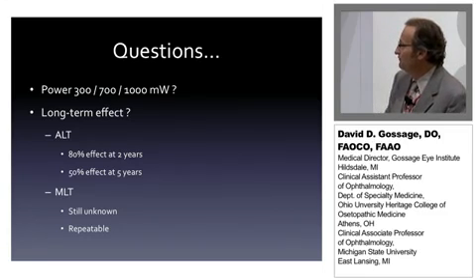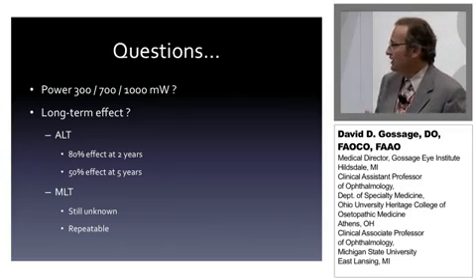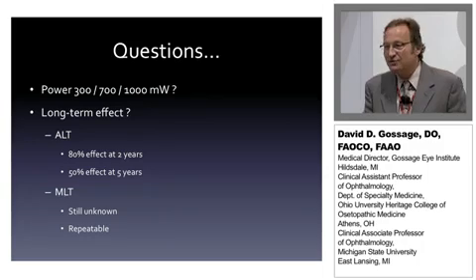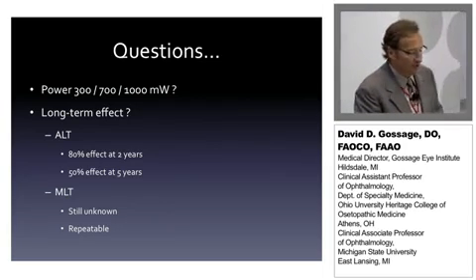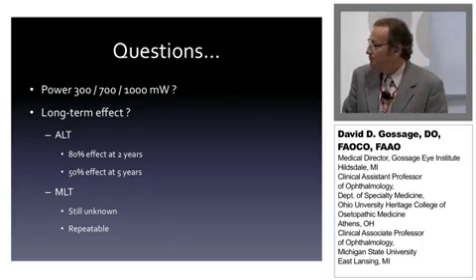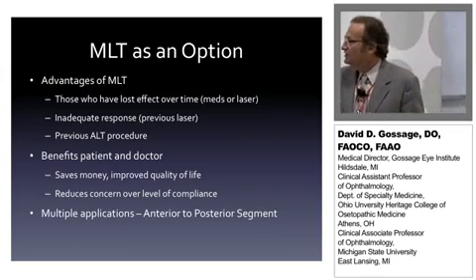Some of the long-term effect with ALT, we know about 80% of those people will have some effect at 2 years and about 50% in 5 years. But with MLT, we don't know. We haven't seen it long enough. We've only been using it for about a year now, and we hope to see some effects lasting a lot longer. But the nice thing about this procedure, though, it is repeatable. So MLT is an option.